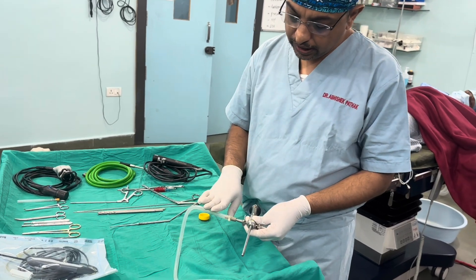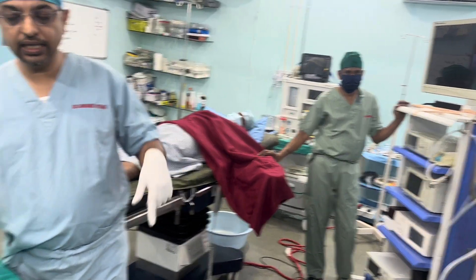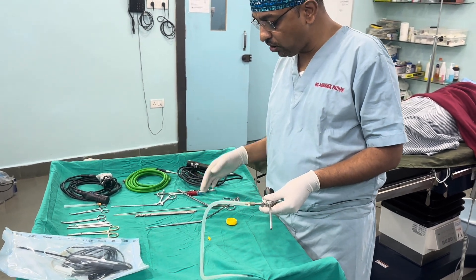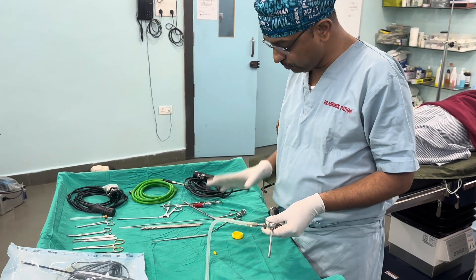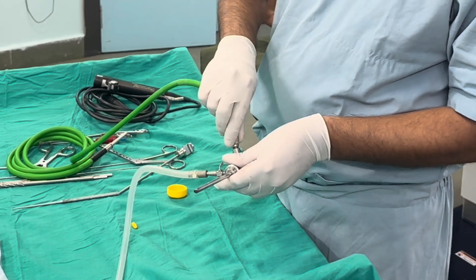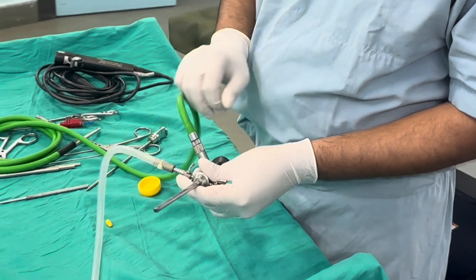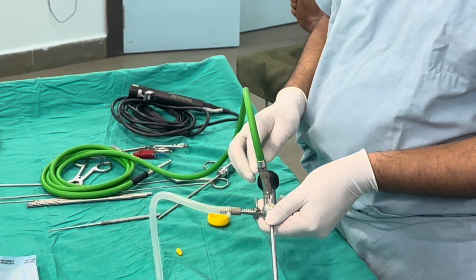This is a water inlet cable connected to the pump. You can also connect it to a 3-litre saline bottle, which works very well in knee arthroscopy. The only two connections required are the water inlet and the light source cable.